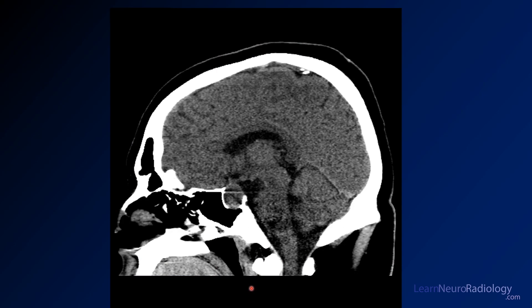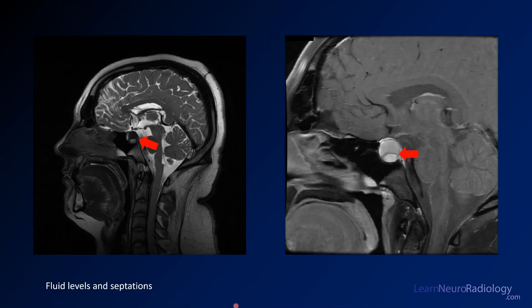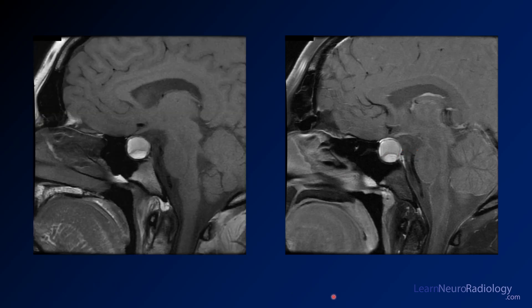On the CT images you can see the sella is expanded — there's osseous expansion of the sella, which means it's something that's been there for a while. Again, a benign lesion but locally aggressive. On the T2 and post-contrast images you can see a little bit of septation, as well as some fluid levels or hemorrhage levels, which clues you in that it might be an adenoma.